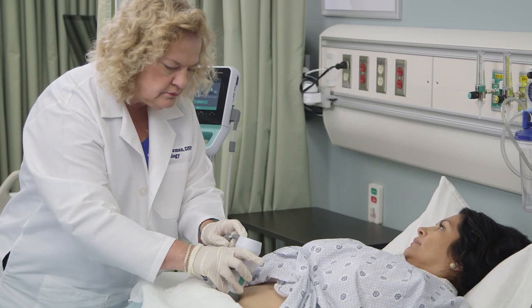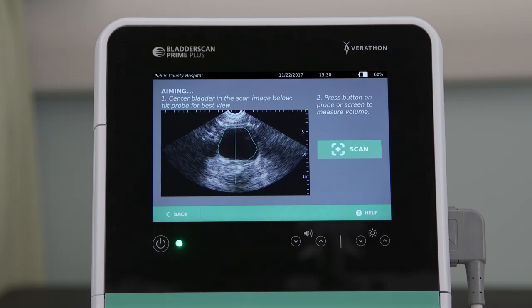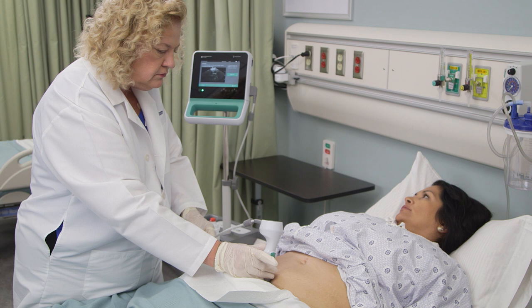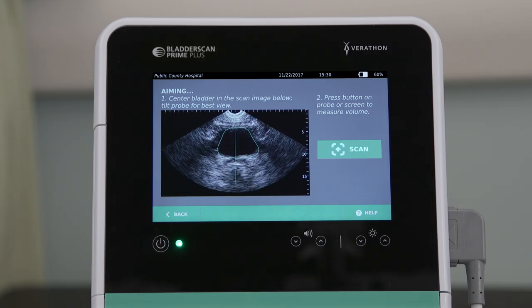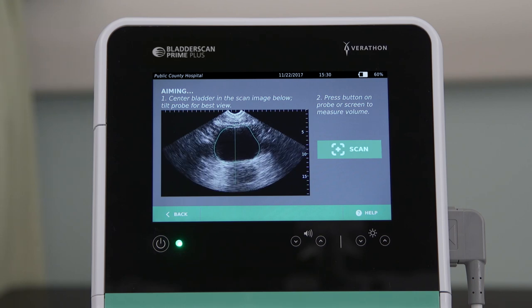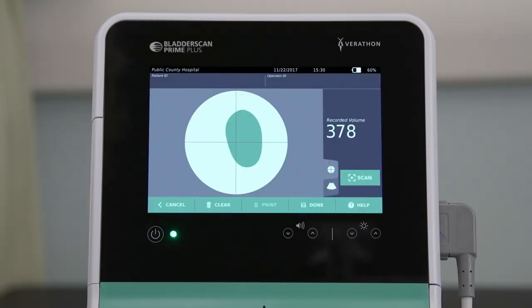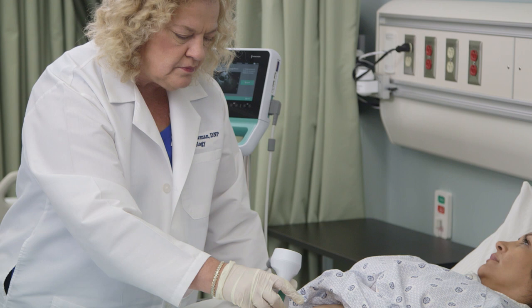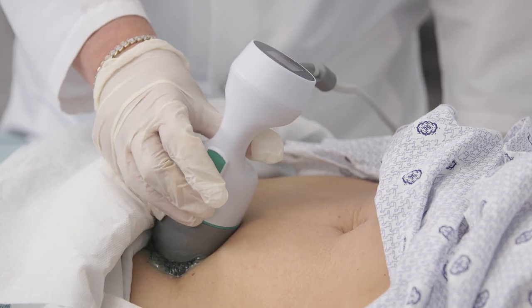To begin live pre-scan aiming, press and release the scan button. Move the probe slowly, using the bladder track feature to center the bladder on the screen. To begin the scan, press and release the scan button or tap scan on the touch screen. Hold the probe steady while the scan is in progress until the volume results are displayed. If the bladder icon is off-center, re-aim the probe, pointing it in the direction indicated to maximize the bladder image.